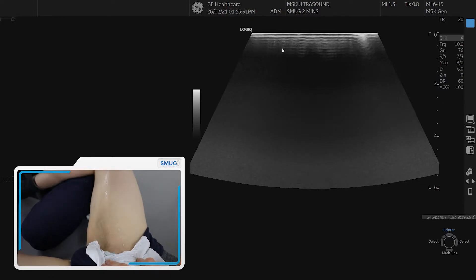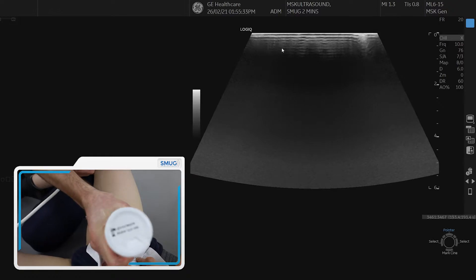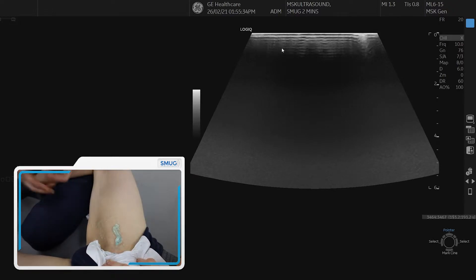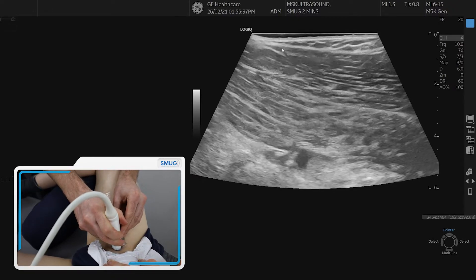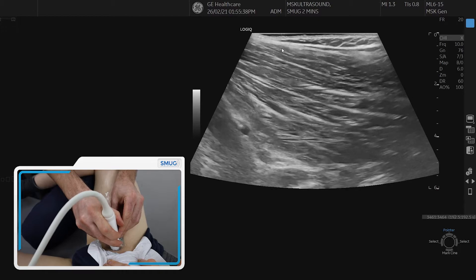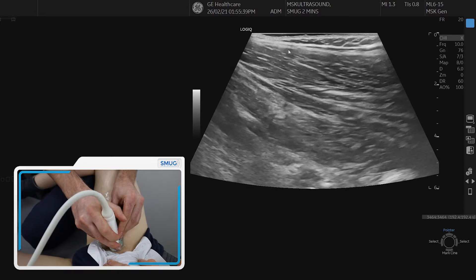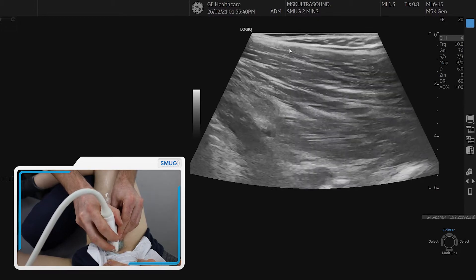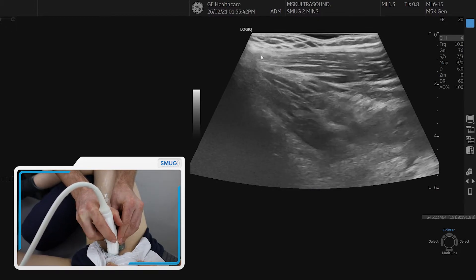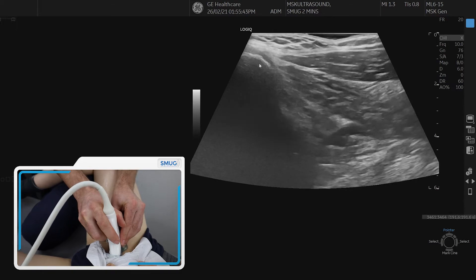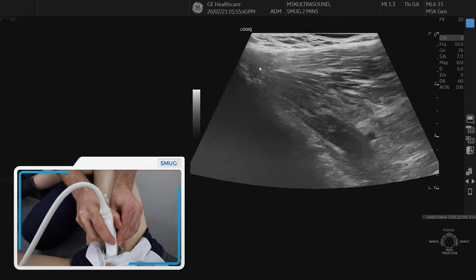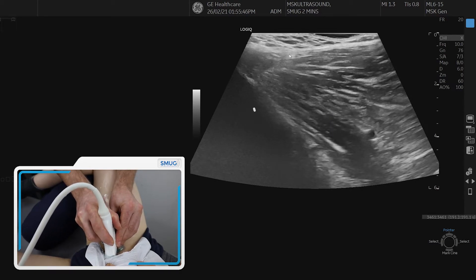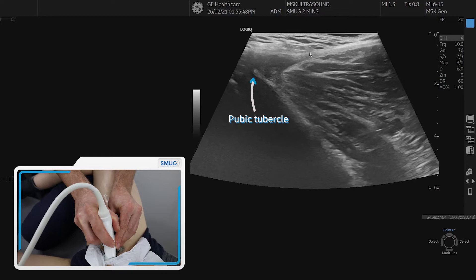Now it is important to have lots of gel in this area. If we find that intramuscular tendon, we can follow it all the way up onto the pubic bone, and there's the attachment onto the pubis.